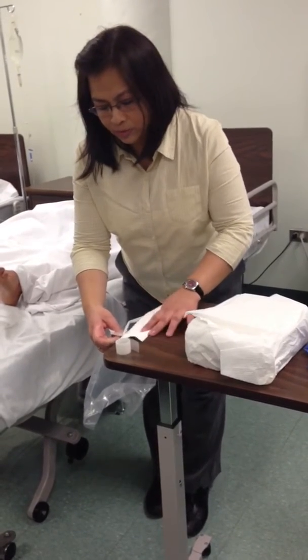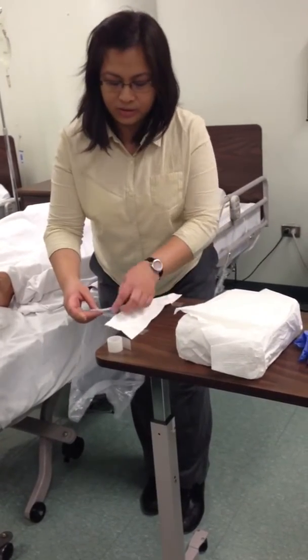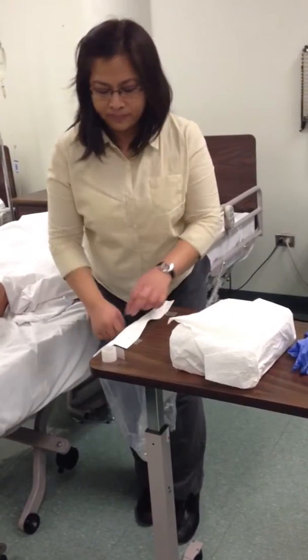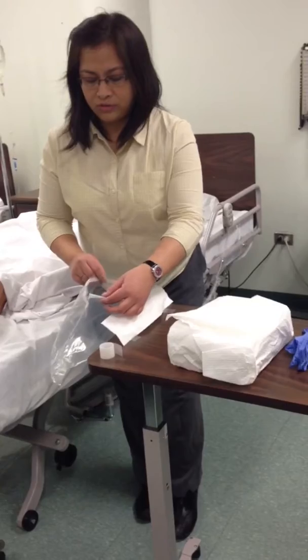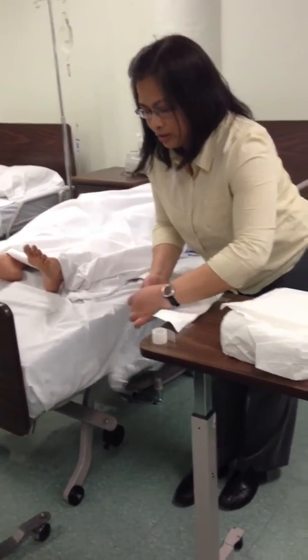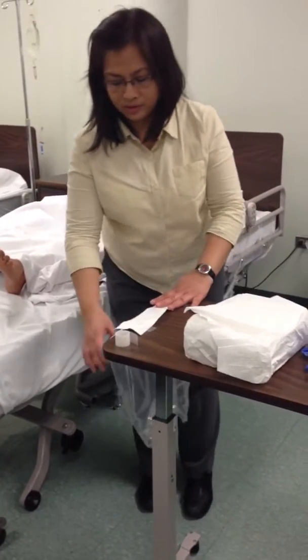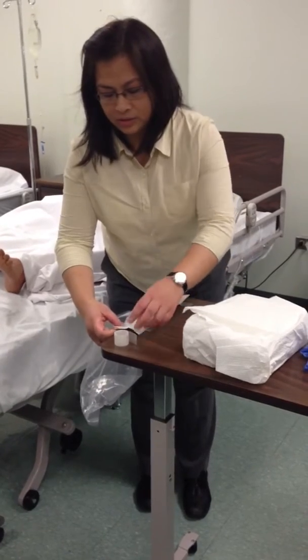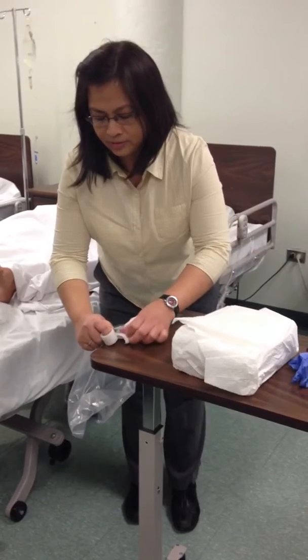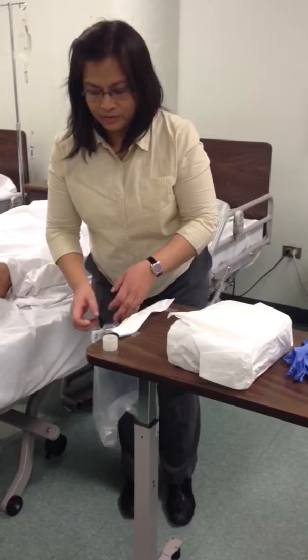And also, when you open the kit, make sure that you don't rip this like this. It has to be connected. You have to open this paper, not removing it from this end, all right? Because you cannot open this really wide if you're not using the paper like this. Since this is already used, I'm gonna have to secure this end like this. All right. So make sure it's open.